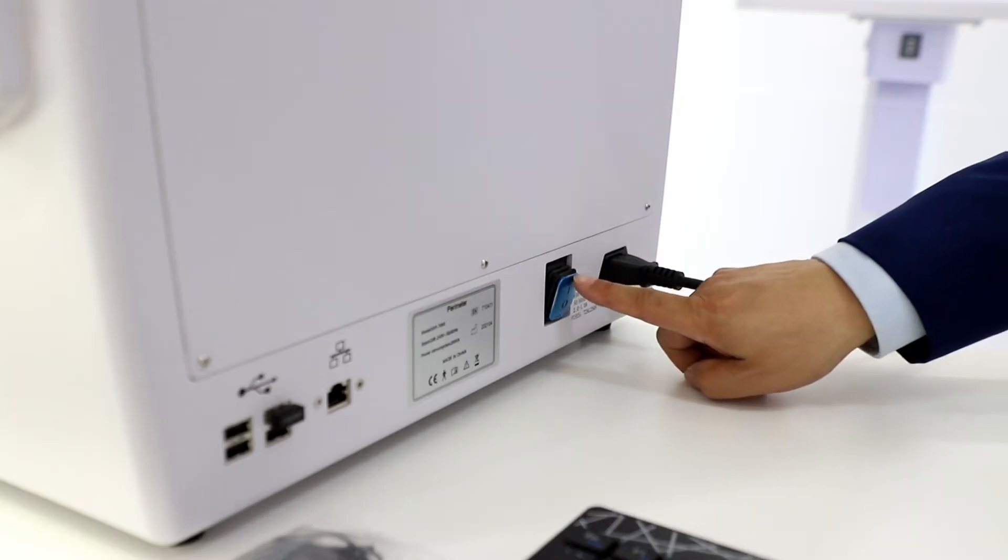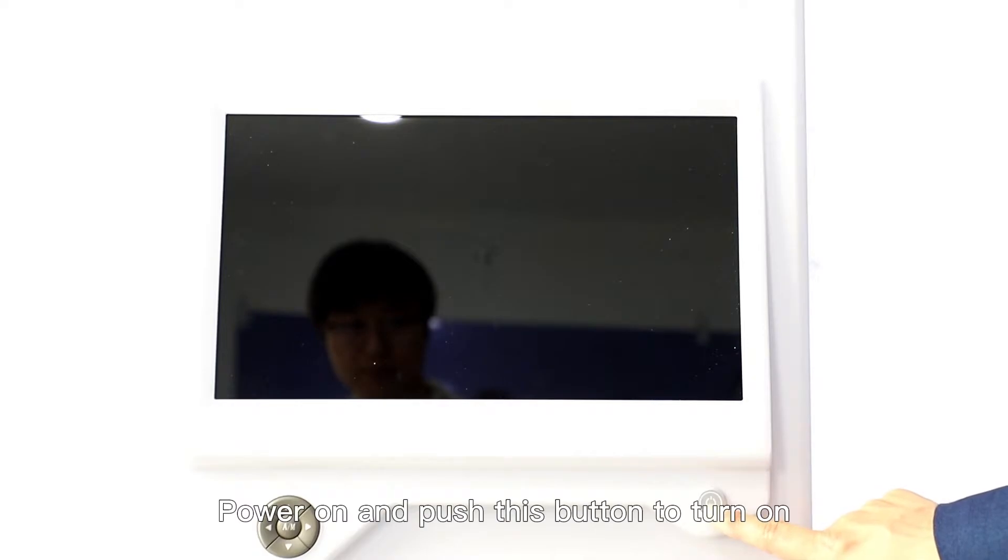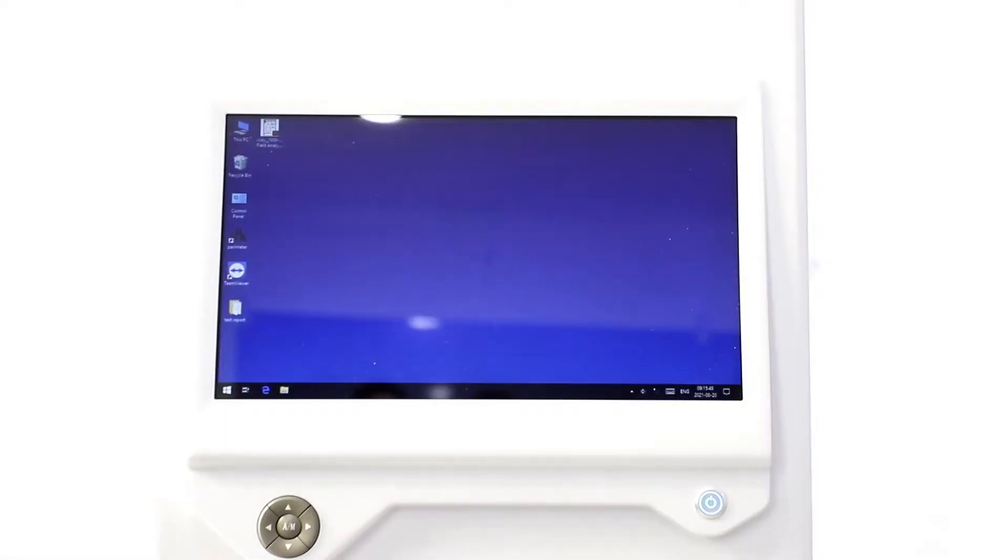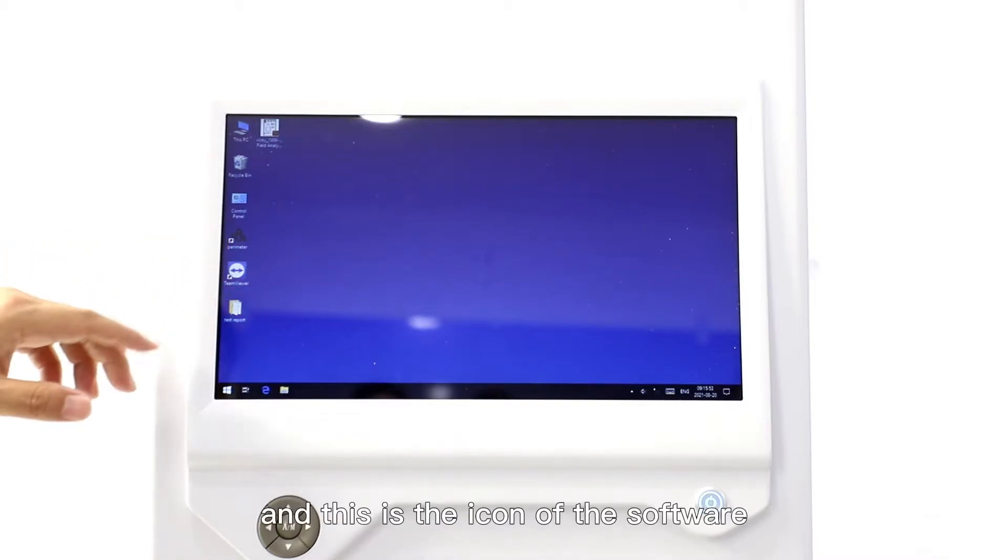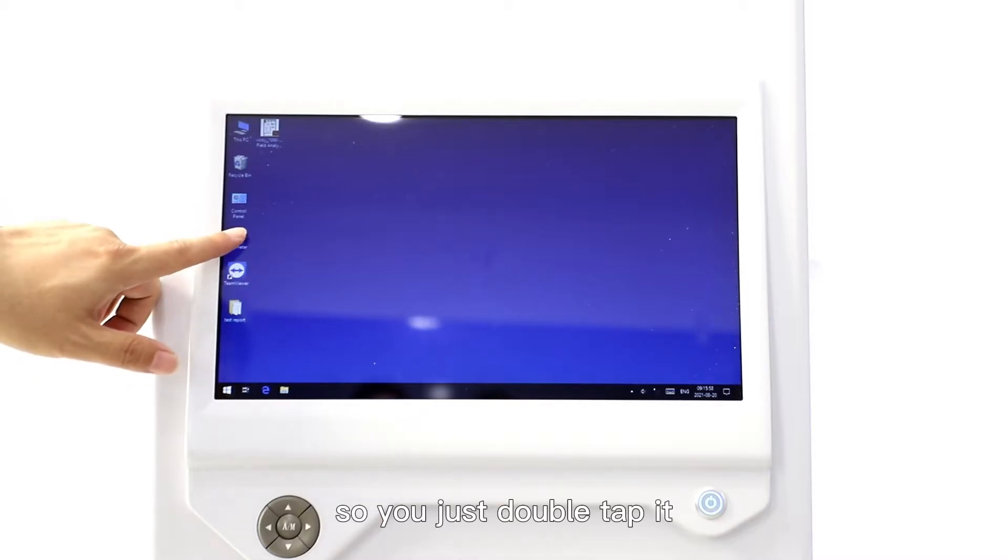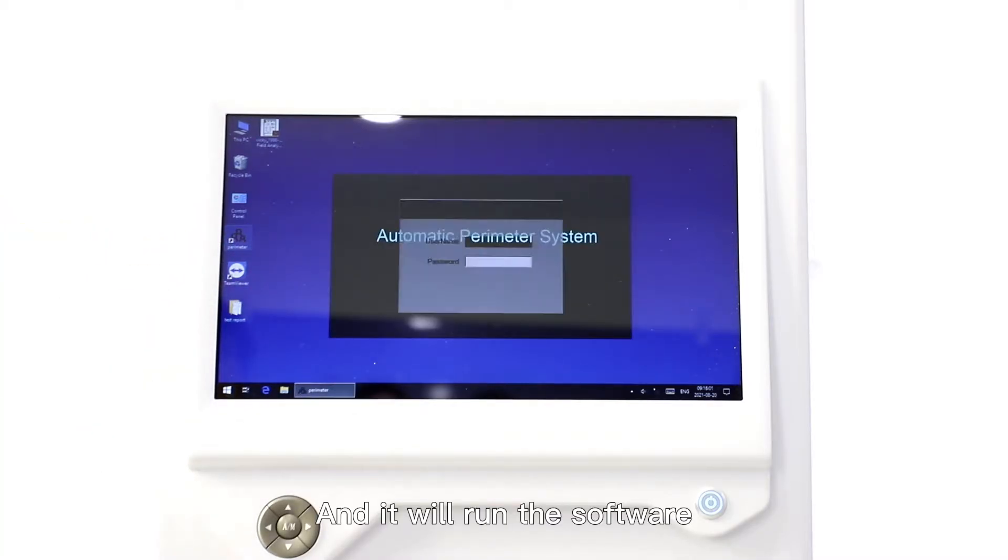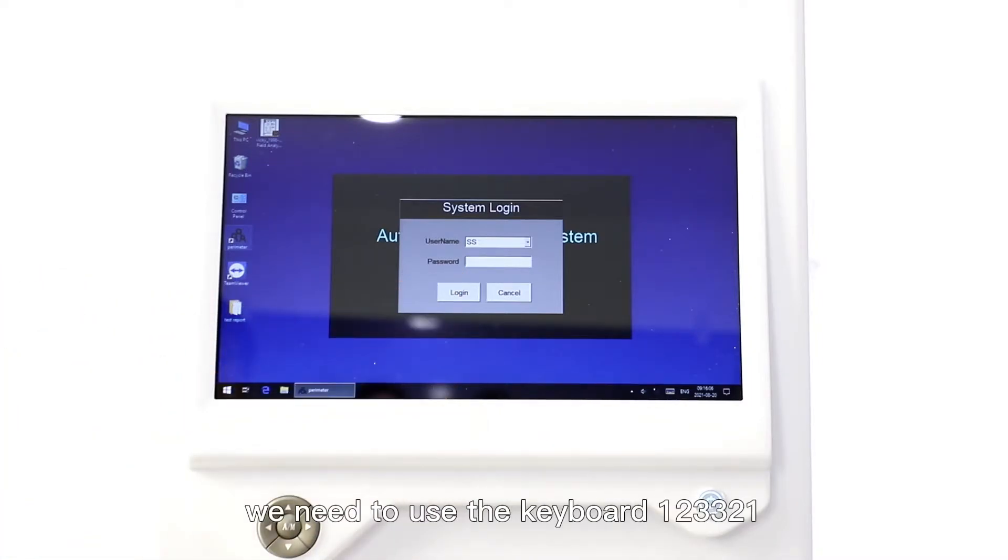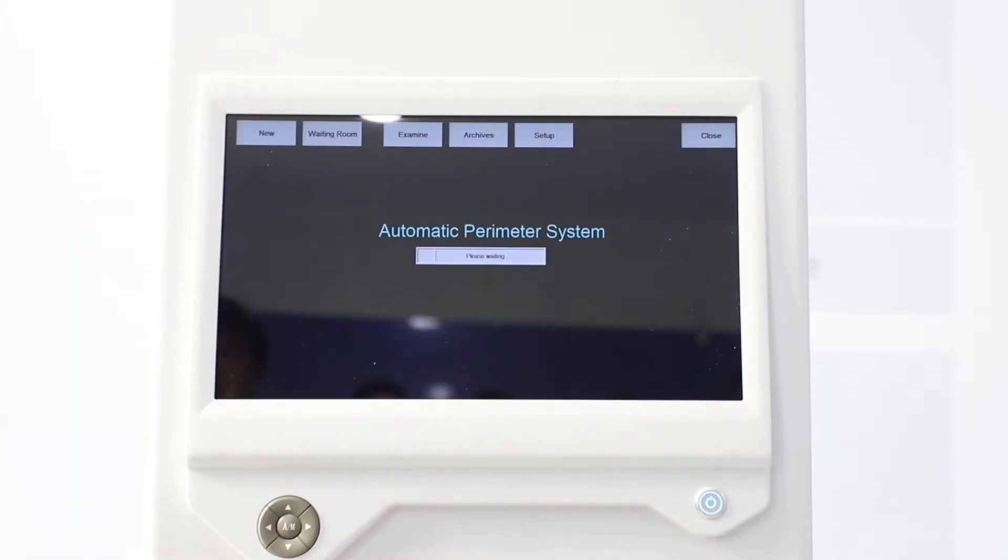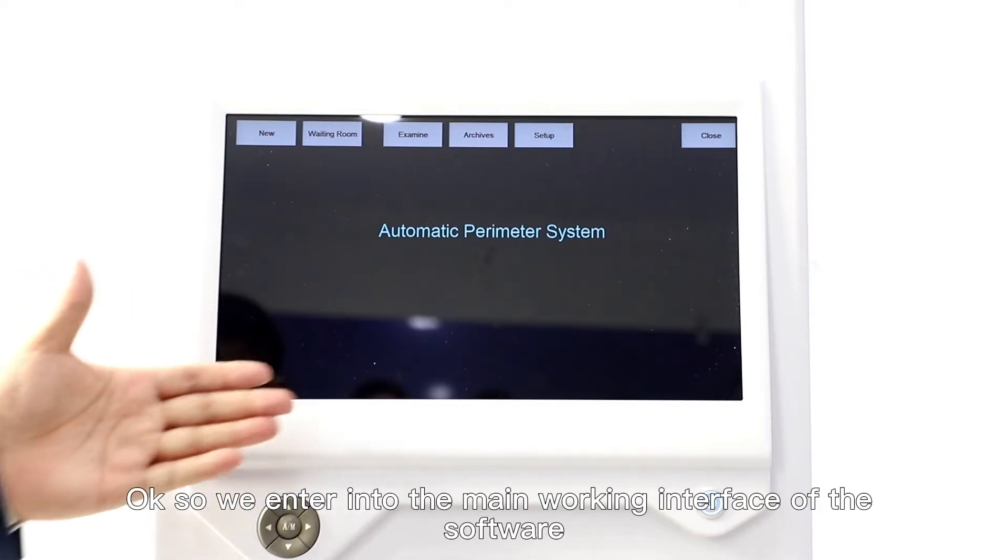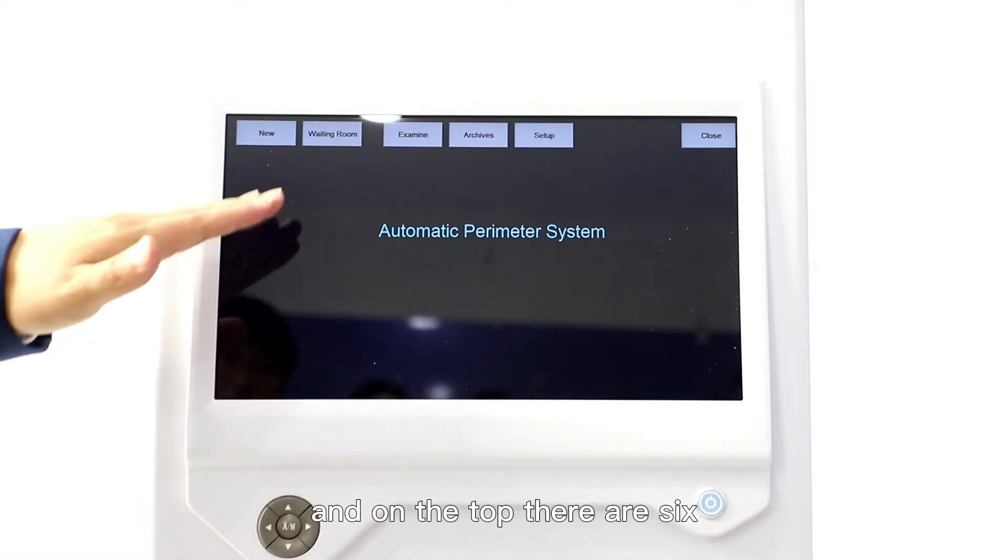Power on and push this button to turn on. This is a Windows operating system based, and this is the icon of the software, so you just double tap it and run the software. You need to enter the password using the keyboard, one two three three two one.